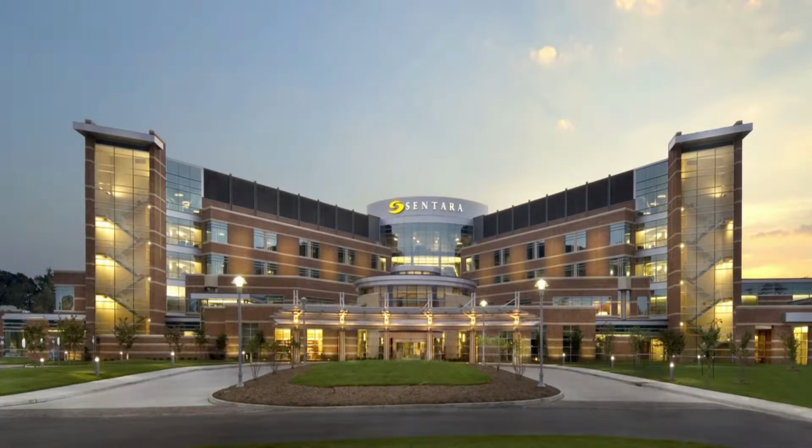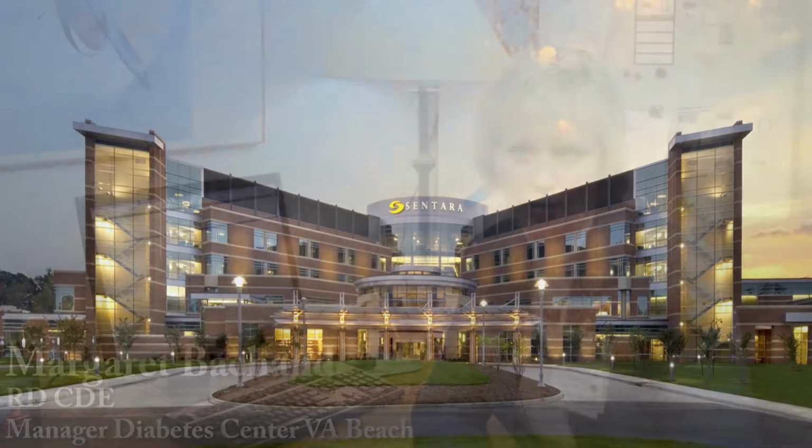I frequently meet nurses that have come from a different healthcare system that is primarily using paper protocols. So I explain it to them that the traditional paper protocol that they've become accustomed to is a linear type of way to manage insulin drips. We're looking at what is the blood sugar right now. And in their experience, and they can usually validate this, when the blood sugar is in target, they're instructed on the paper protocol to turn the drip off.